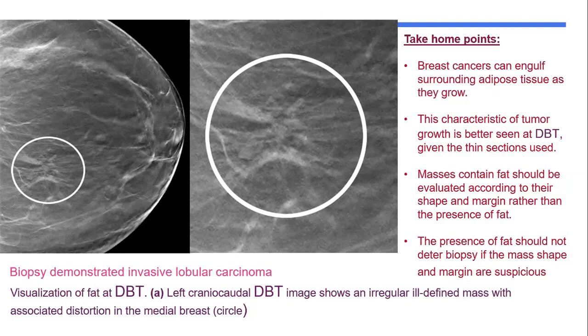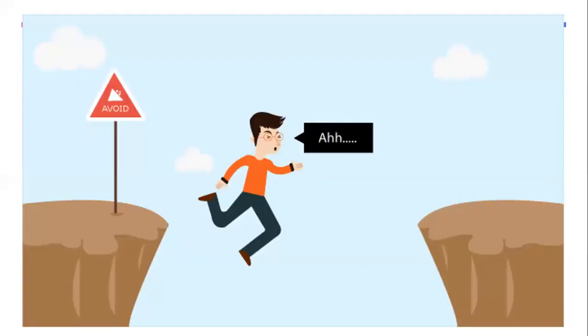Encapsulated fat is usually seen with a benign lesion. Now we went through all the cases, as a reader or observer, to overcome this and to avoid falling into this pitfall.